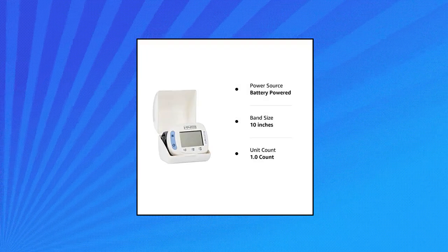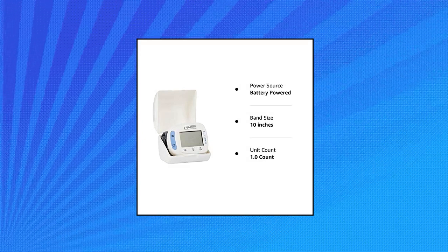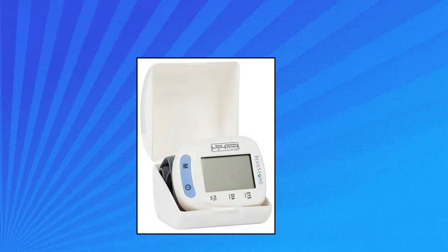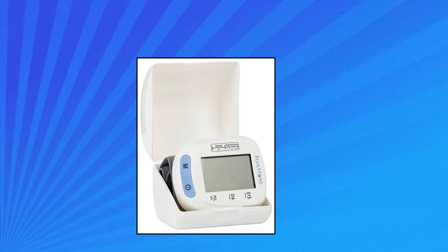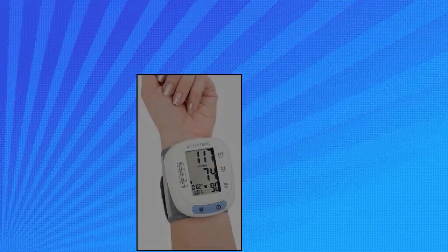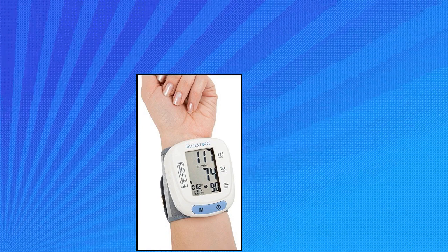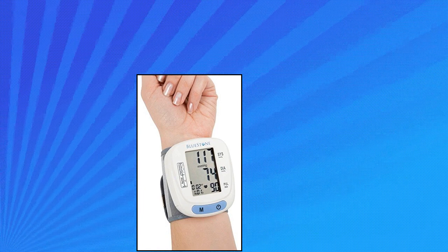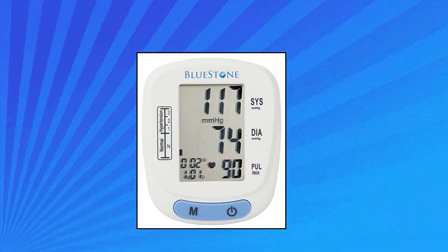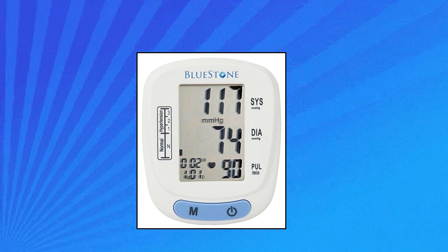Blood pressure monitor with heart rate — automatic wrist cuff blood pressure machine with LCD display. Read your pulse and systolic and diastolic blood pressures quickly with this automatic blood pressure cuff. Simply place the cuff around your wrist and touch the power button for fast, fuss-free readings on the large LCD display. Designed to meet standards set by the World Health Organization, this BP monitor includes a hypertension indicator so you know when to seek medical help.